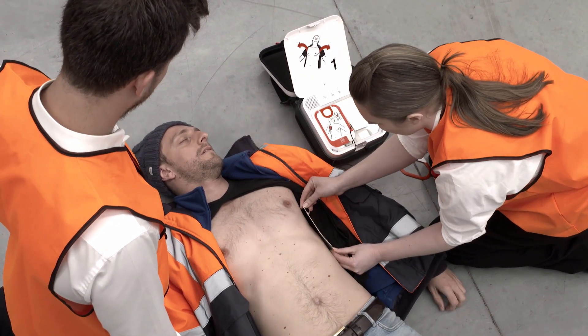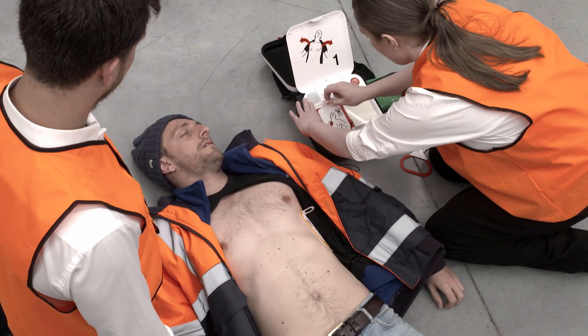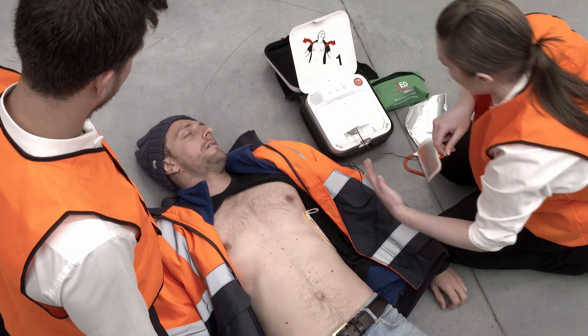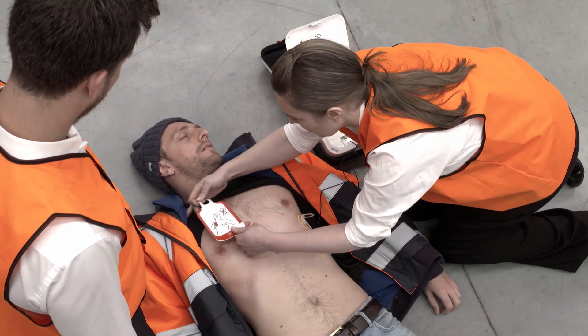The CR2 has an inbuilt metronome and provides real-time CPR feedback to ensure even untrained rescuers provide the best possible assistance to the patient. Press pads firmly.